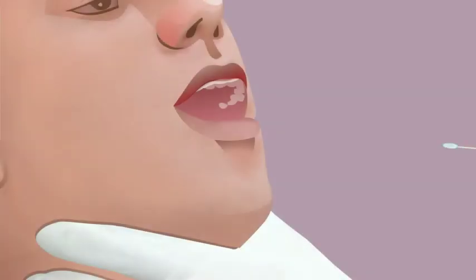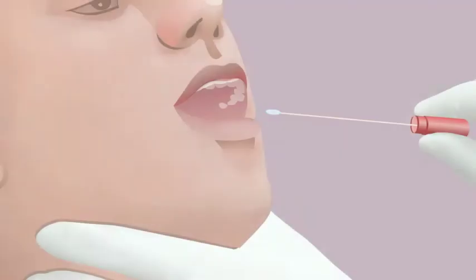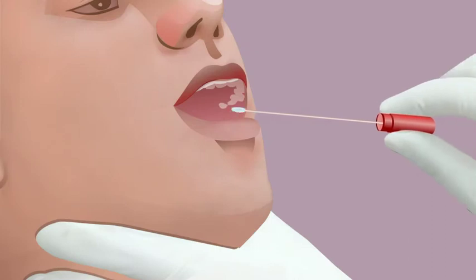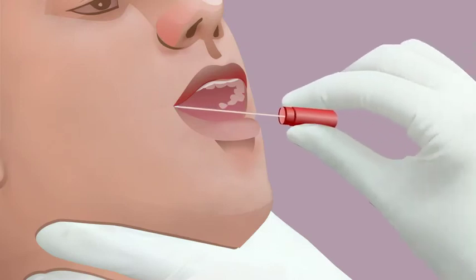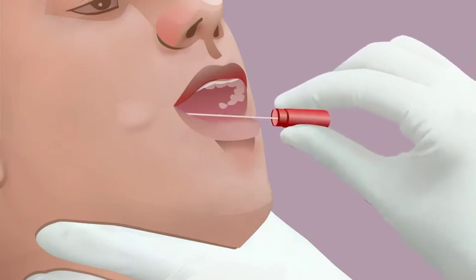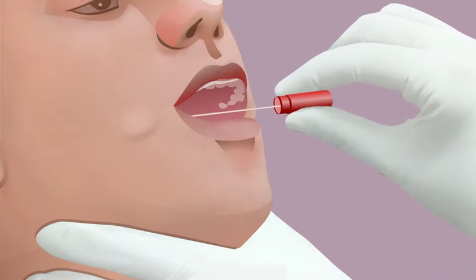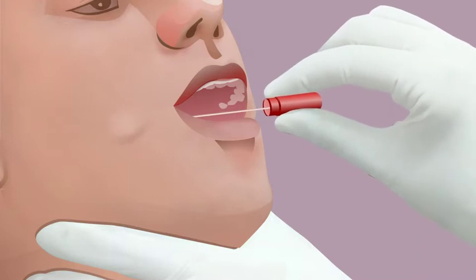Insert the swab without touching the lips, teeth, tongue, cheeks, or uvula. Gently but quickly swab the tonsillar area from side to side, making contact with any inflamed or purulent sites.